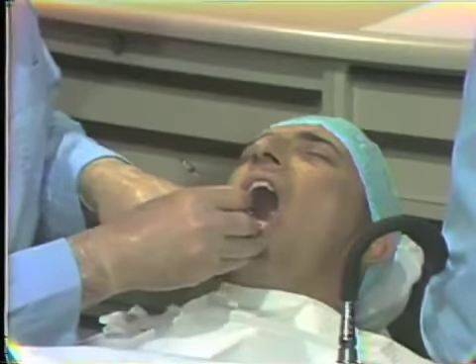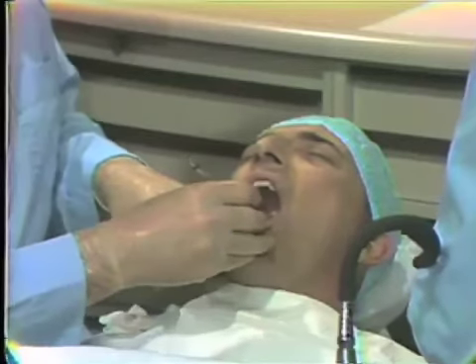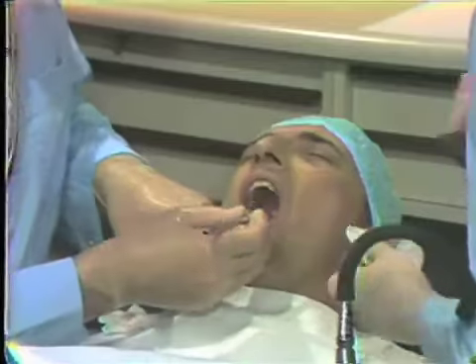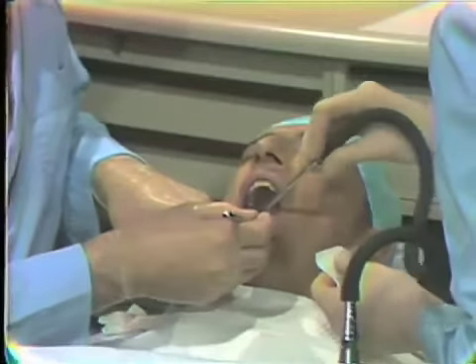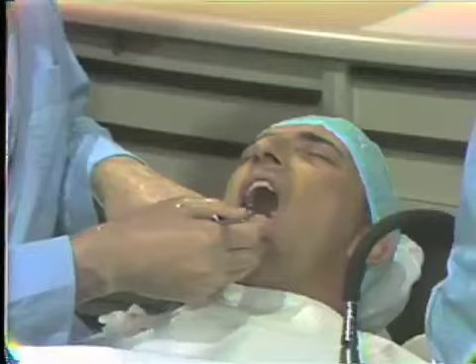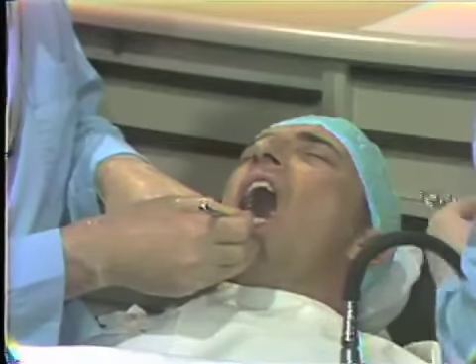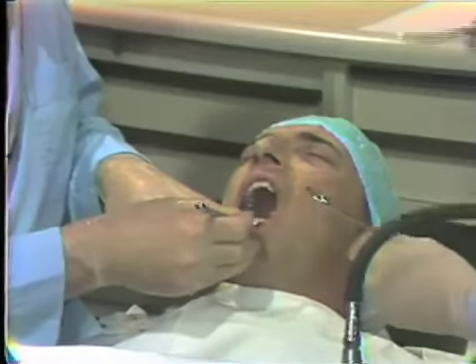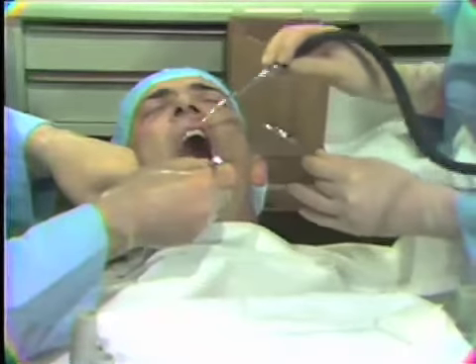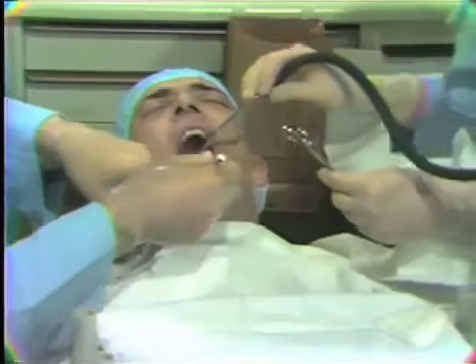Many times you will note that there are some tags of tissue along the underside of the flap or around the edges of the flap. As the assistant stands by then with the scissors, we are able to move with the scissors into the flap area to remove the tags of tissue on the flap, to possibly reshape the flap so that the contour is more appropriate for replacing and suturing.